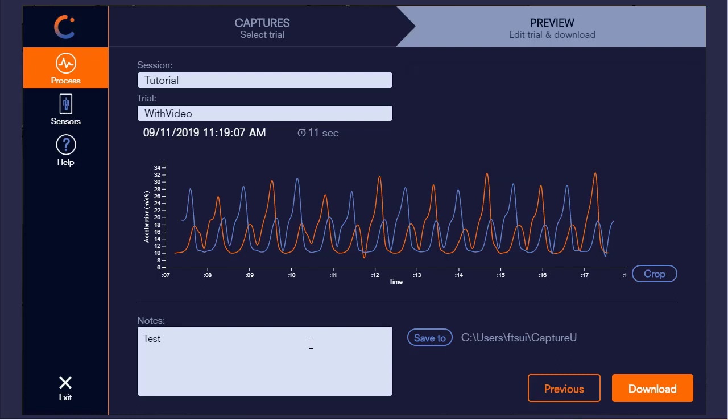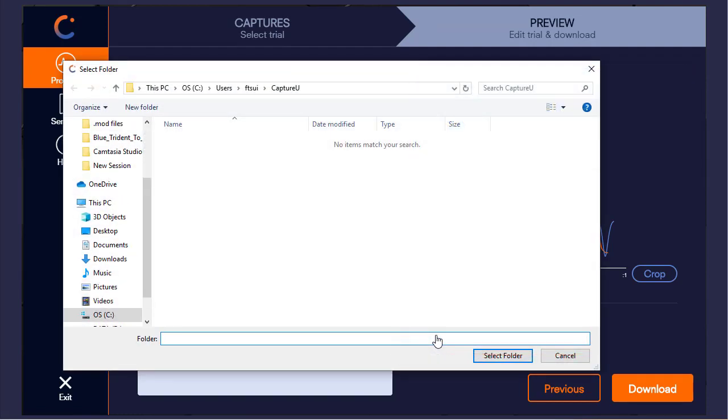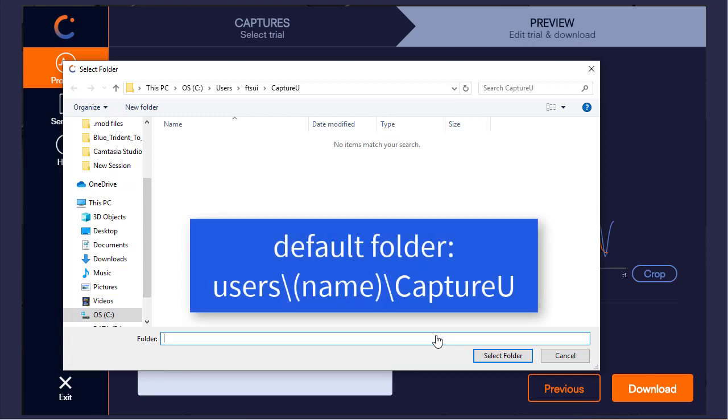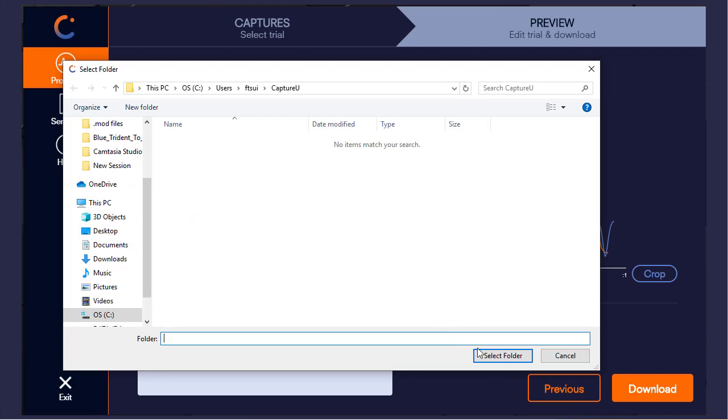The last field to specify is the data path. Click on save to and select your desired folder. Please note that this user slash CaptureU is the default folder location, so I will keep this and just select the folder.